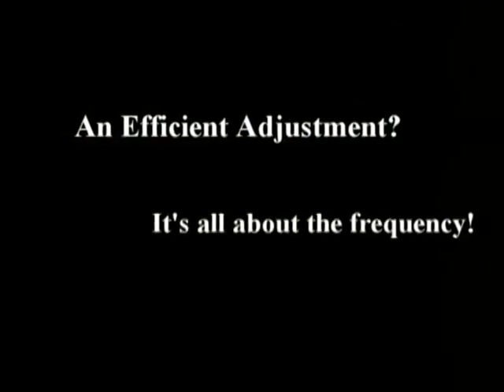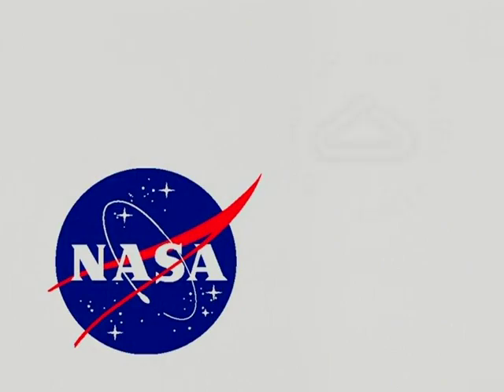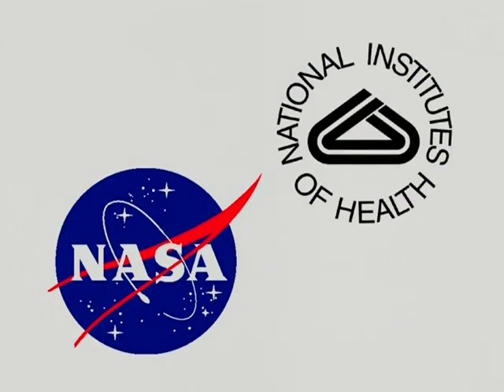Over the past 20 years, I have conducted spine biomechanics research with university support and funding from government agencies, including NASA and the National Institutes of Health. During the past 5 years, Dr. Colloca and I have published a number of papers that deal specifically with the importance of impulse frequency content in accomplishing the chiropractic adjustment. The rate at which the force is being applied to the body directly influences the frequency content of the adjustment. So if the correct frequency is delivered, then mechanically sensitive structures are optimally stimulated.